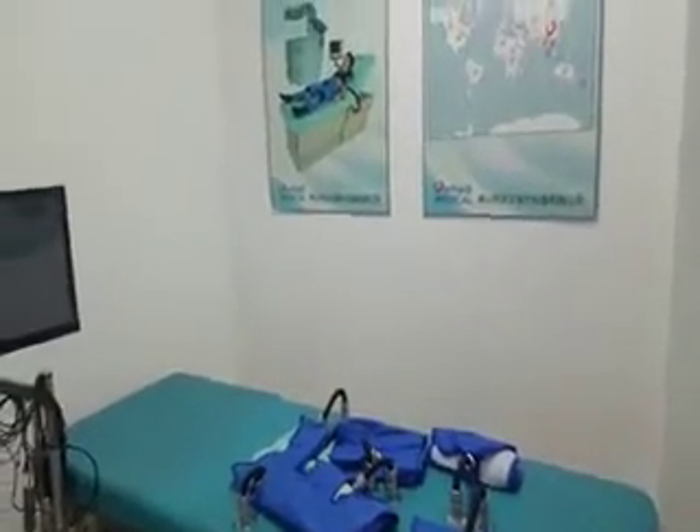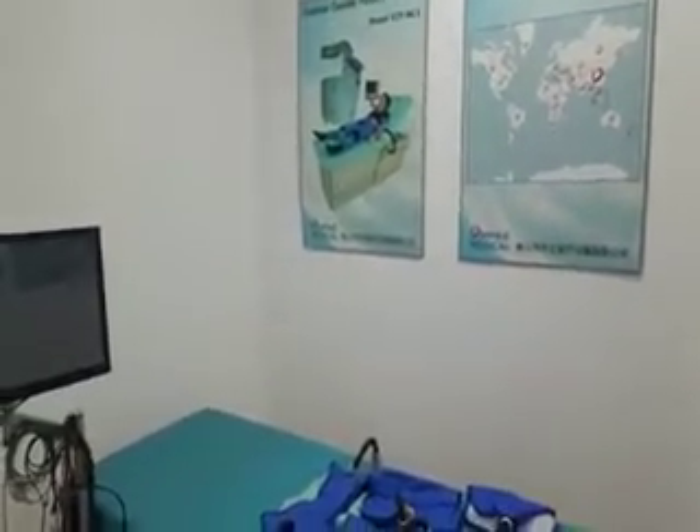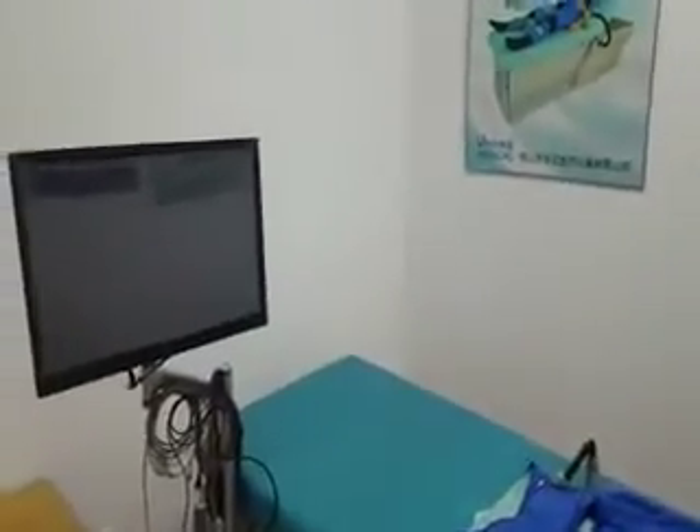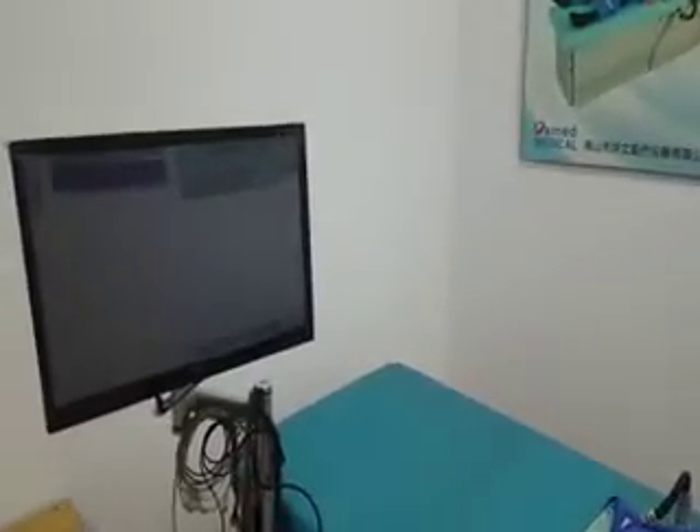Welcome to the Yumen Medical ECP MC3 product. Through this video, you will learn how to use the ECP MC3 equipment safely and effectively.